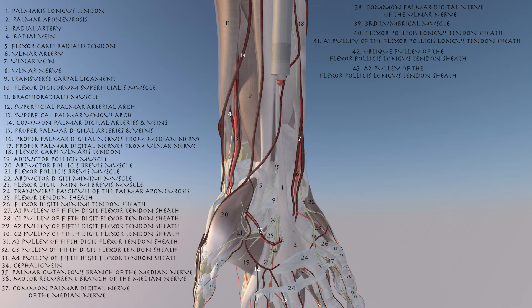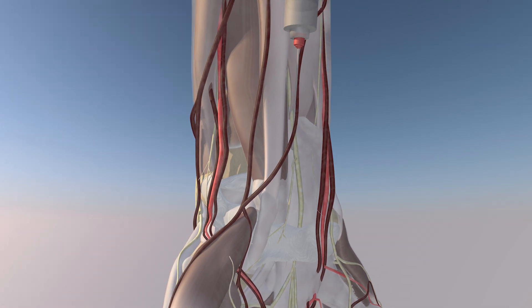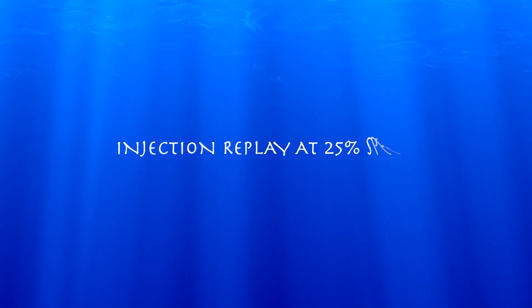Here we're going to go over hydrodissection of the median nerve for chronic carpal tunnel. Here you can see some of the anatomic structures labeled. This is an in-plane approach and we're looking at the median nerve during this procedure in a long axis view. You can see the tip of the needle just next to the median nerve and we're essentially injecting our injectate just above and around the median nerve.